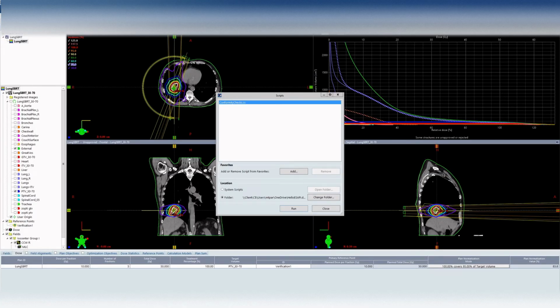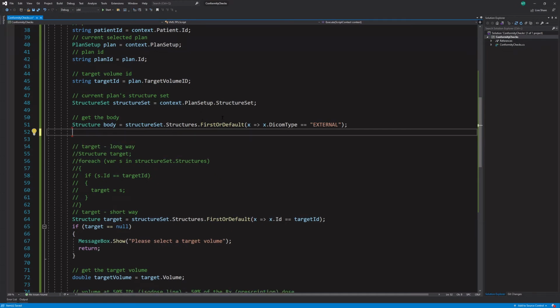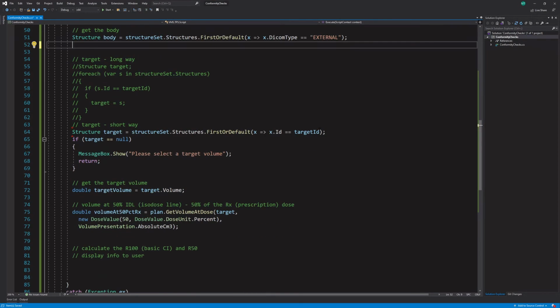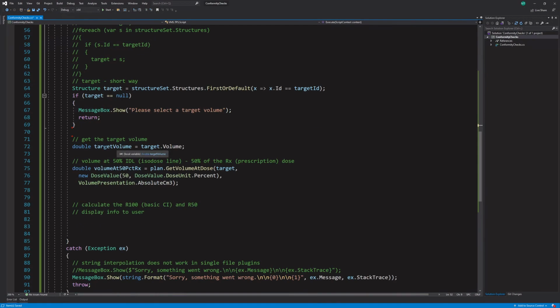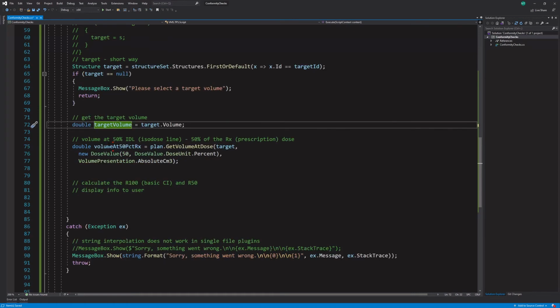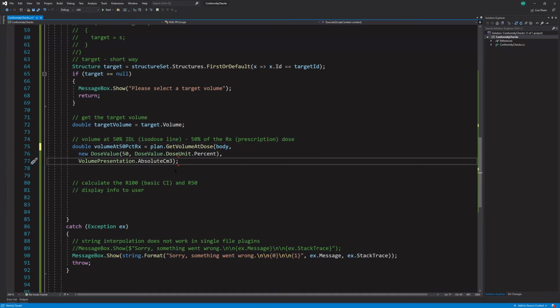Okay. So let's go back to our code. Okay. So we got that. All right. So we've successfully gotten the body structure. So that is what we want. We want the body. Actually, may not even need. Oh, well, we need the target volume. So we've gotten that. Okay, so we actually want to get the 50% isodose line of the body structure. Duh. Okay, and then let's just copy this.